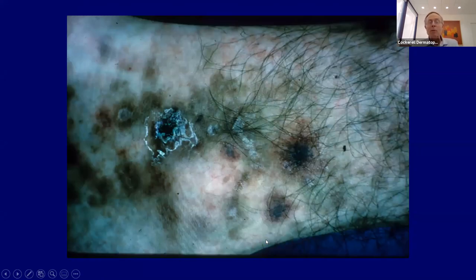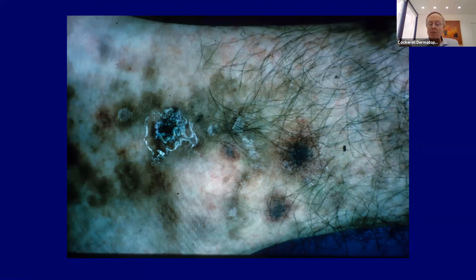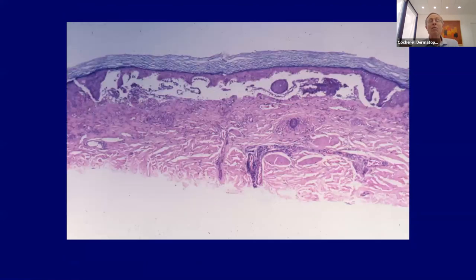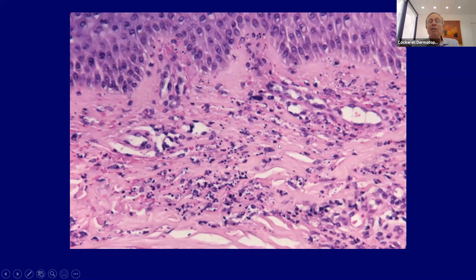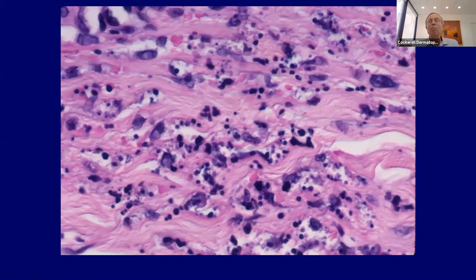Here's a late lesion — these have been around for a long time. The palpable purpura is all gone. Now we just have lots of extravasated erythrocytes, some crusting where the epidermis broke down. This is a burned-out lesion. The histologic specificity is less than a classic fully developed lesion. But you can still see residual neutrophilic dust and maybe a little residual fibrin in some of these blood vessels.